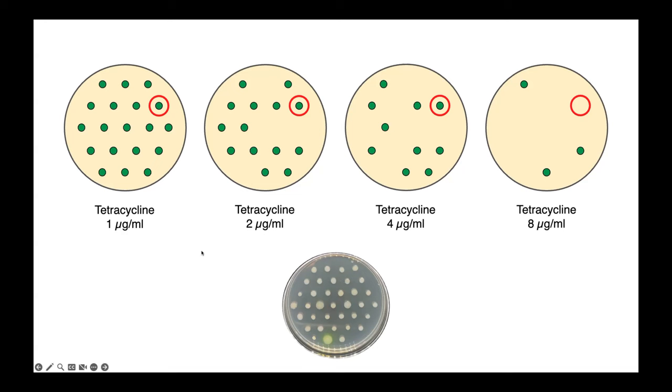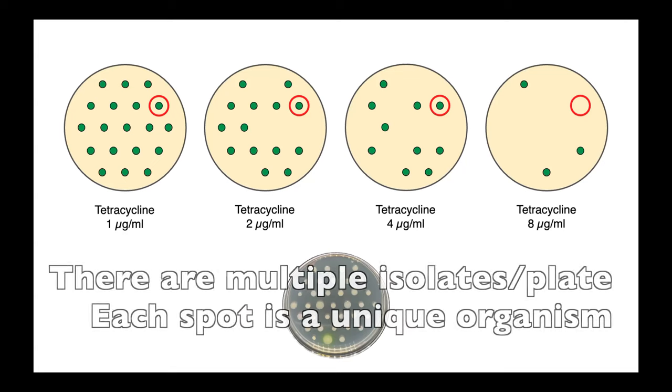This is a dilution series of tetracycline from 1, 2, 4, and 8 micrograms per milliliter. Each of these plates has been inoculated with a bacterial isolate and incubated overnight.